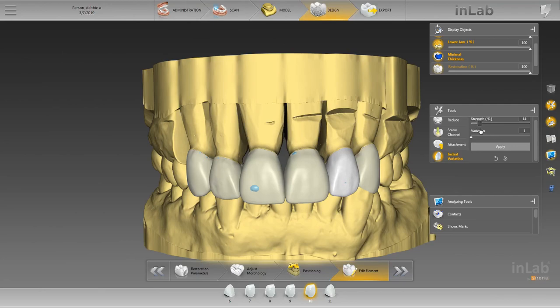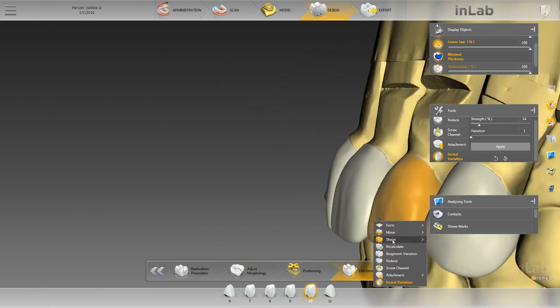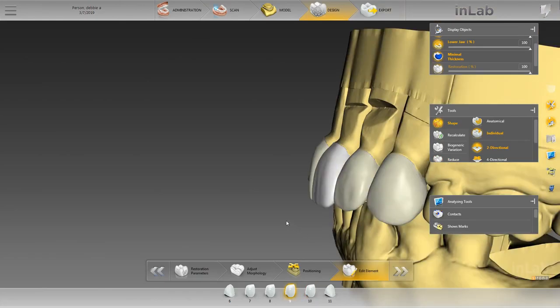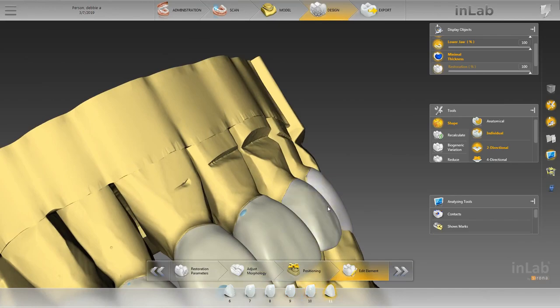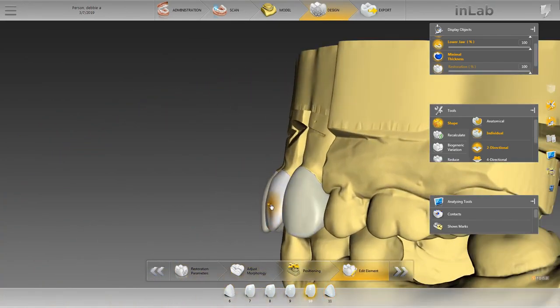And because this one's so much longer, we may want to go with 2, 3, 1. We're going to stick with 1. We were at around 15, I think it was. Just hit on 14. And same thing, shape tool. Bring it out just slightly. And if you look at it from this angle, you'll see all the same. I like that from that angle.